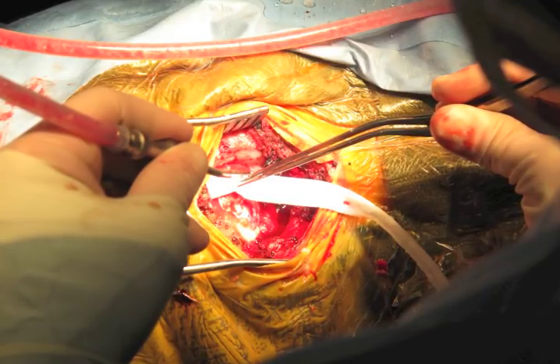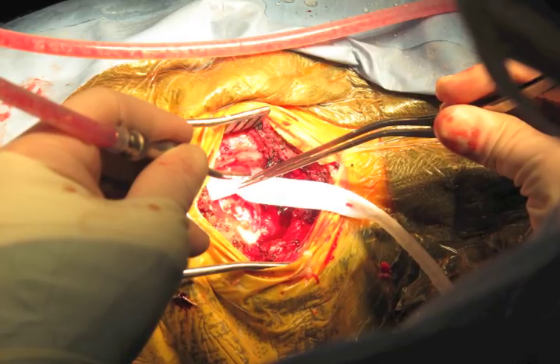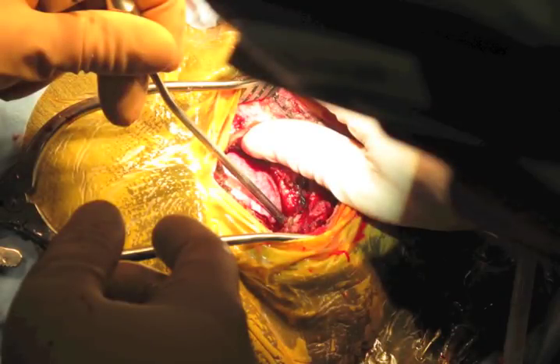Emissary vein bleeding is controlled with wax. Sinus bleeding is controlled with Gelfoam and gentle pressure. The mastoid air cells, when violated, should be thoroughly waxed.